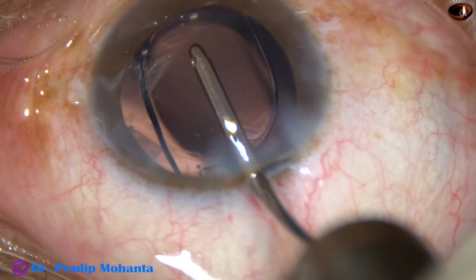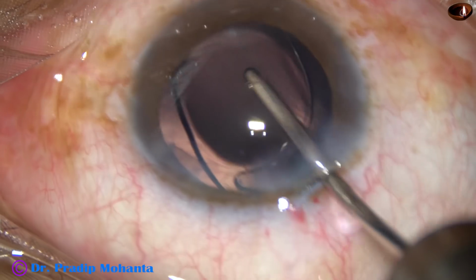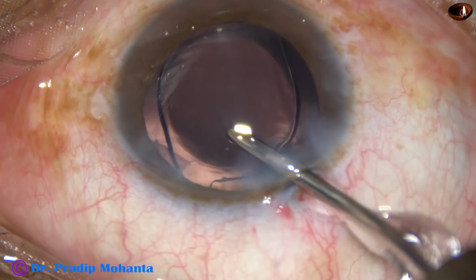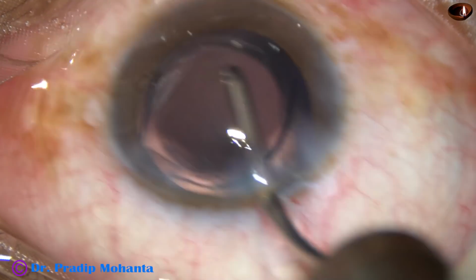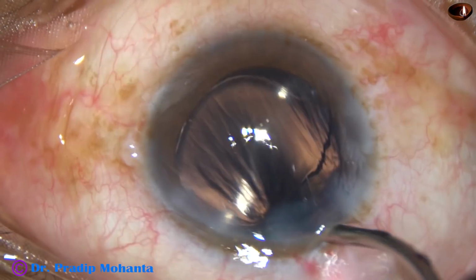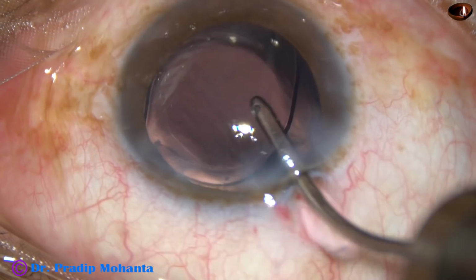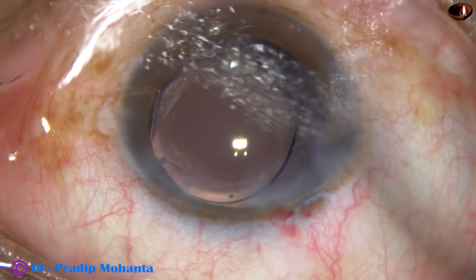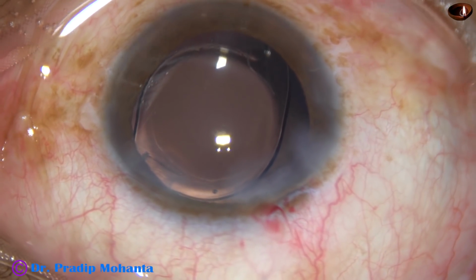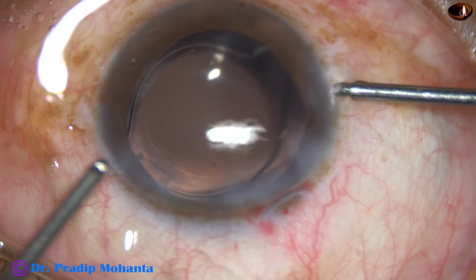In this case, what has happened is the leading haptic is stuck to the optic. Let's wait for some time. It may get released by itself. Yes, it has got released by itself. So before applying instruments, just wait for a few seconds. It may get released by itself. Sometimes two haptics are in handshake posture. Just wait for 5-10 seconds. If it doesn't, then you inject visco and tease the two haptics and they will get released.